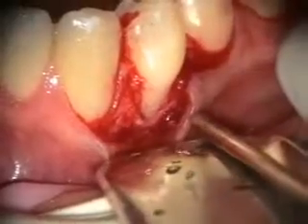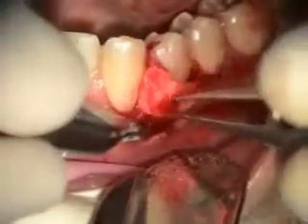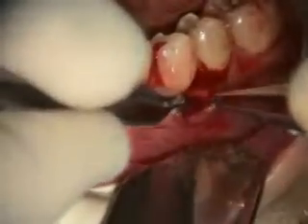I treated the root with some tetracycline. Now I've got the alloderm shaped, and I'm ready to suture.